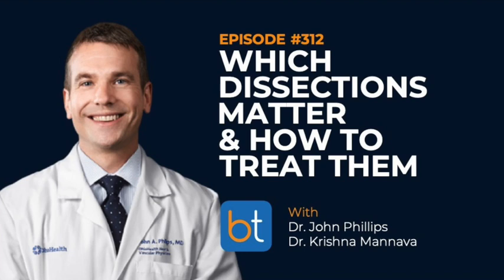I have not run into that issue because I always try to convey to people that this is not a stent, but it's a scaffold, but it gets billed as a stent. I've talked to our coding folks, and they have not run into any issues. Interestingly enough, we're running into some issues with lithotripsy in the peripheral, but we're not running into any issues with tack yet. John, if you use a lot of DCB and drug-coated technology, do you think that there's a difference, POBA versus DCB, whether you have to put in metal or use tacks?